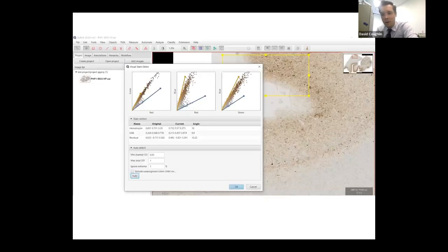I did want to give you a couple of screenshots to show how this looks, since it's easier to see than to talk about sometimes. This is what the QuPath terminal will look like. What I've done here is a hippocampal slice, and we're up in the transentorhinal cortex, it looks like. I selected a region so that we could actually do some red, blue, green color vector tuning. So the box in the back is the annotation. It has a little bit of neurofibrillary tangle pathology.